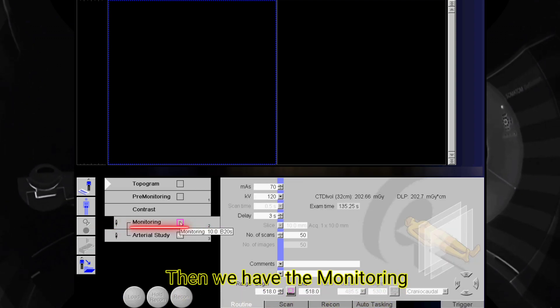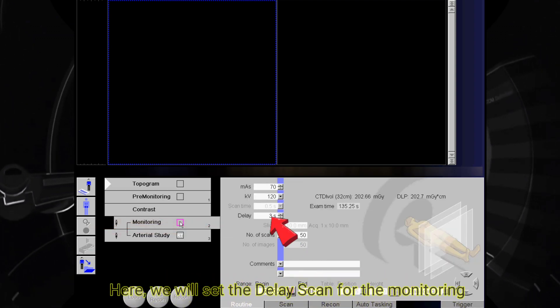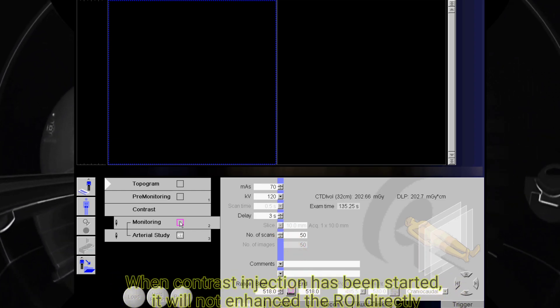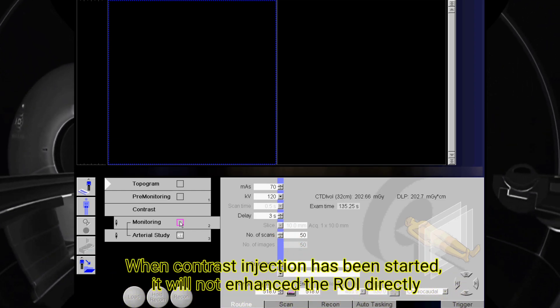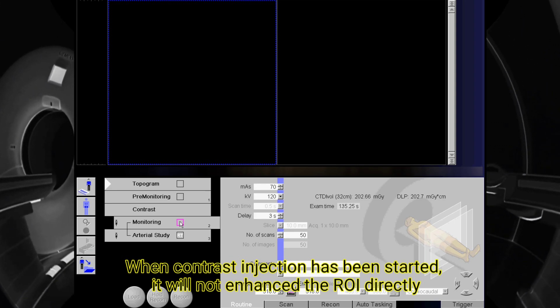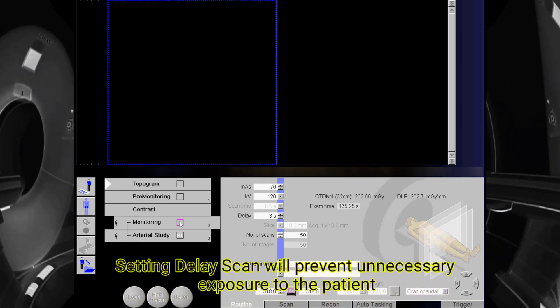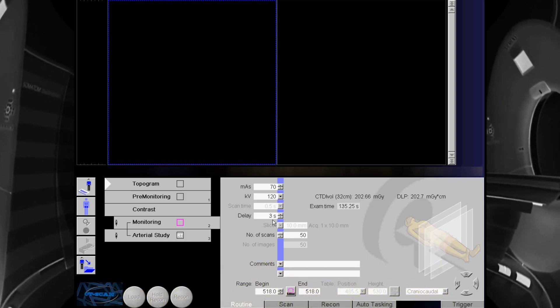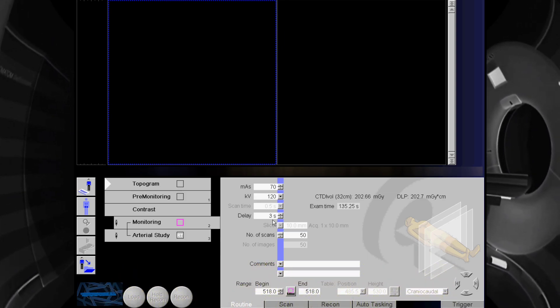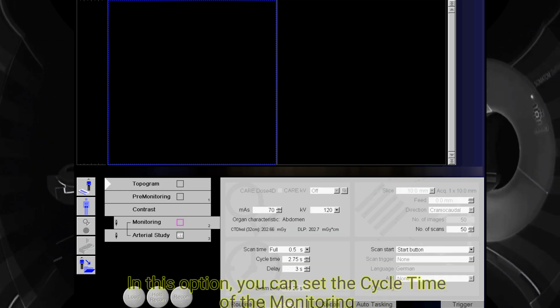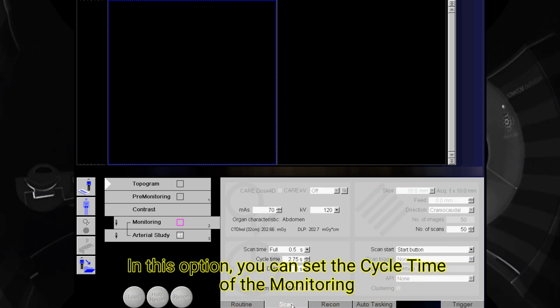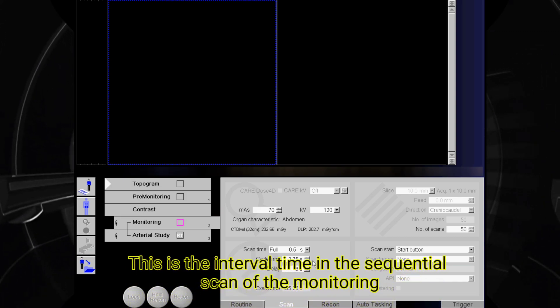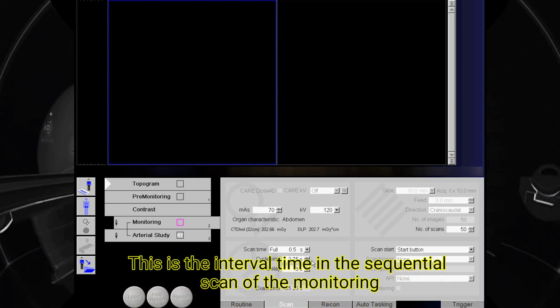Then we have the monitoring. Here we will set the delay scan for the monitoring. When contrast injection has been started, it will not enhance the ROI directly. Setting a delay scan will prevent unnecessary exposure to the patient. In this option, you can set the cycle time of the monitoring, the interval time, and the sequential scan of the monitoring.